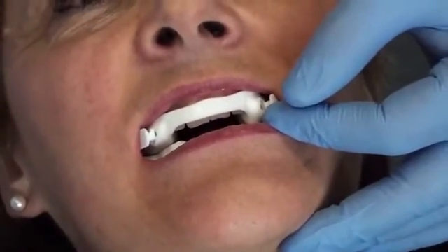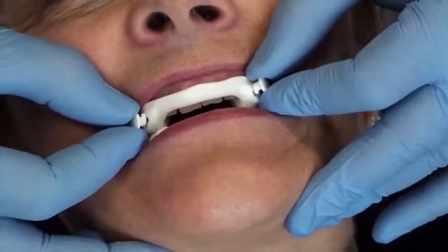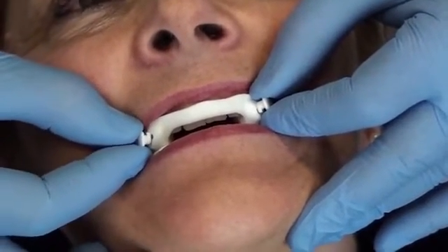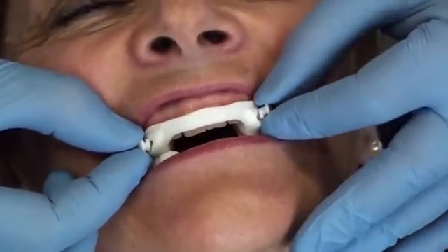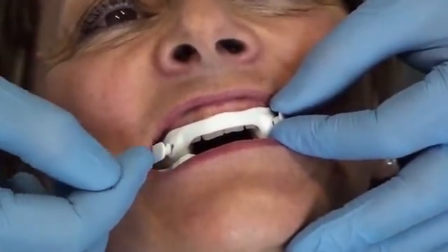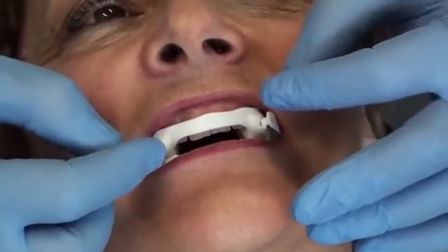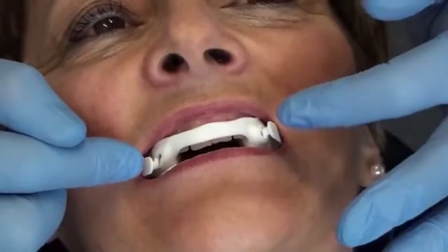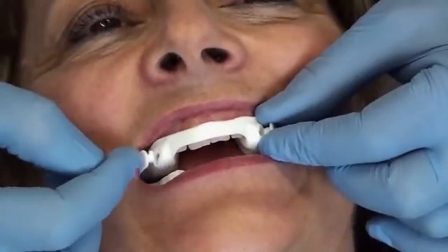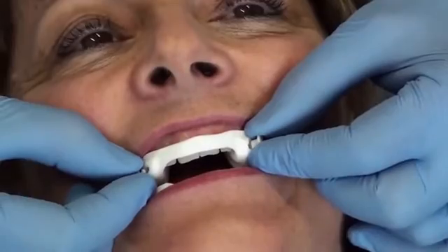To the patient: do you feel intense pressure on your lower jaw? Is it comfortable? Afterwards, we ask the patient to move her lower jaw forward and backwards — forward, backwards, then forward — and the person stops moving. We position the left and right rods. If both cylinders face the insert holes, then we consider that the 25 mm rods match the advancement captured with the George gauge. If these rods go beyond the insert holes, it means that the George gauge did not register an advancement position of 100%. Consequently, the 25 mm rods may correspond to only 23 or 24 mm, as the case may be.